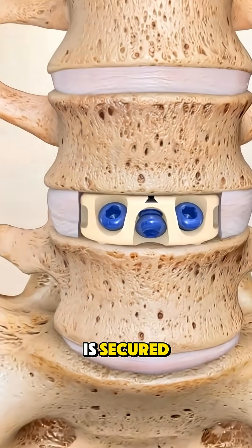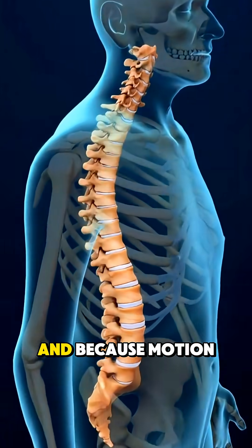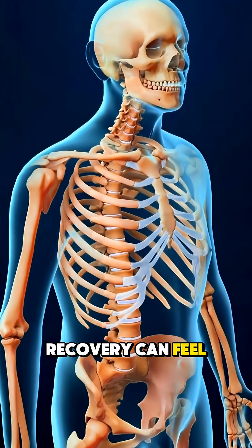Once the disc is secured, the surgeon closes the incision layer by layer and the patient is moved to recovery. Many people stand and walk later the same day, and because motion is preserved instead of fused, recovery can feel more natural.